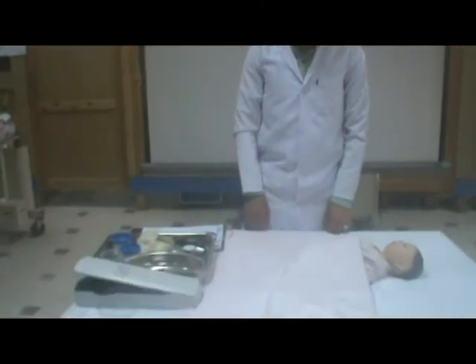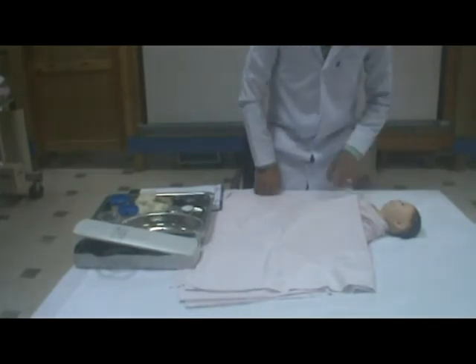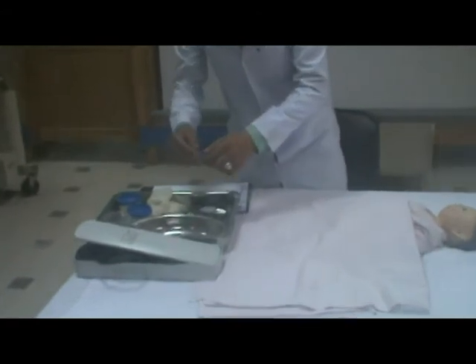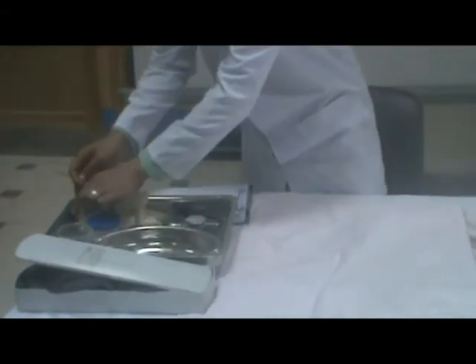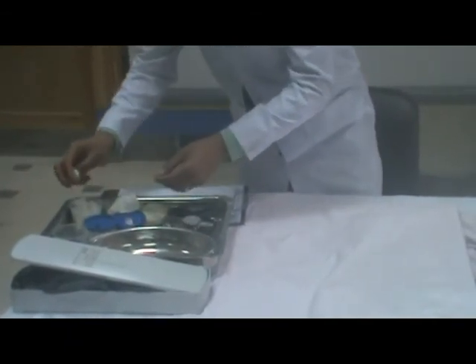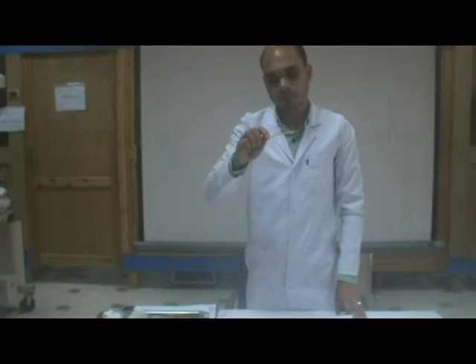Oral temperature steps. Number 1, check that the child has not just had a cold or hot drink to provide an accurate measurement. Number 2, clean the thermometer with an alcohol swab to reduce transmission of infection. Number 3, check the thermometer to see that the reading is down below 35 Celsius.